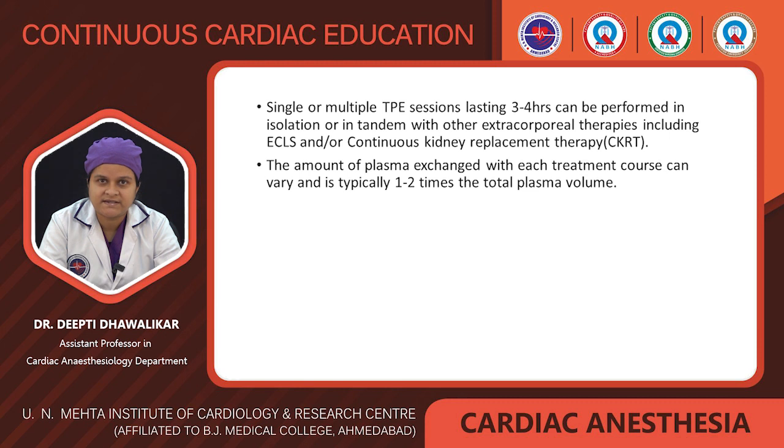Single or multiple TPE sessions lasting 3 to 4 hours can be performed in isolation or in tandem with other extracorporeal therapies, including ECLS and/or continuous kidney replacement therapy, that is CKRT. The amount of plasma exchanged with each treatment course can vary and is typically 1 to 2 times the total plasma volume.